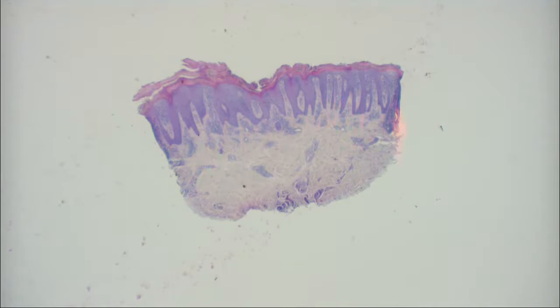What about the acanthosis? Yeah, it's very regular. Very regular, isn't it? Very thin, elongated epidermal rete ridges. You kind of draw a line around the bottom of them, and they're pretty much all about the same thickness, if you will. There's parakeratosis, as you noted. What else do you see?